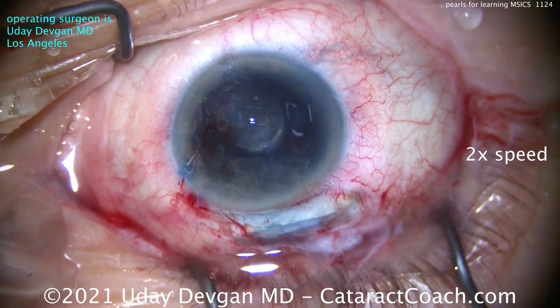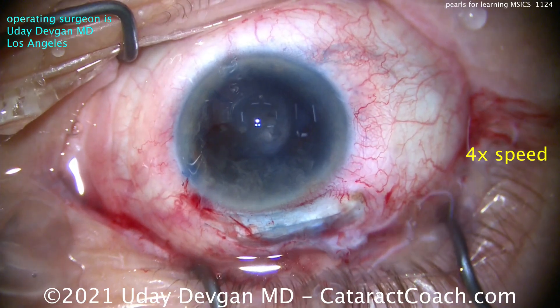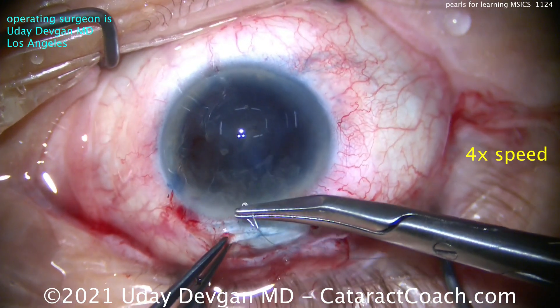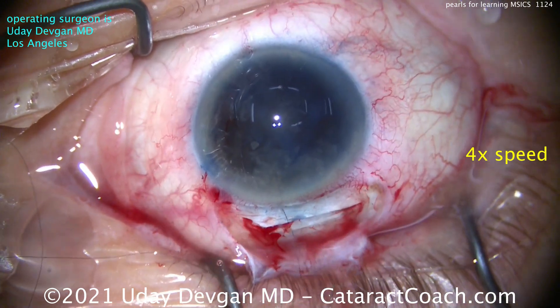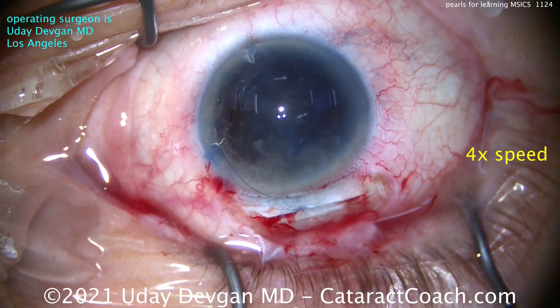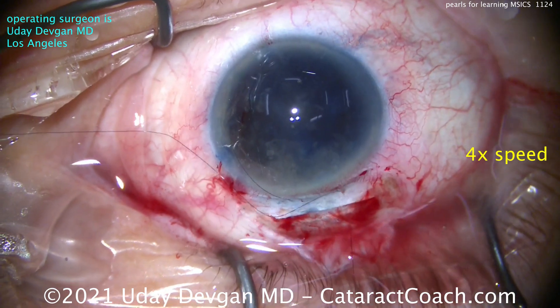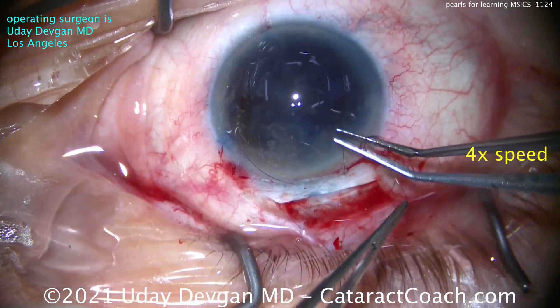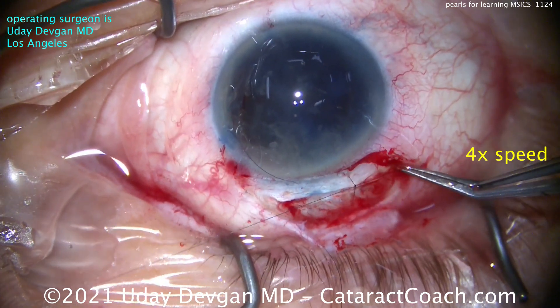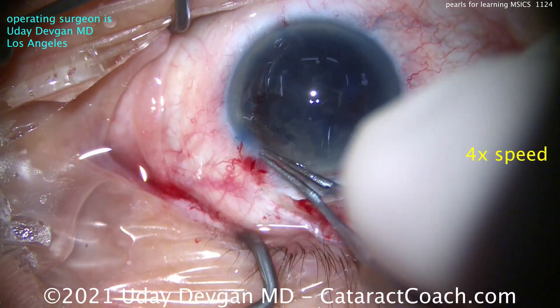If yours gets stuck, you may have to enlarge your incision slightly. Get that nucleus off the field — you can see just how opaque it is. Now for suturing: we place two sutures to trisect the main incision. The main incision is about nine millimeters wide, so two sutures give three segments each about three millimeters wide. While some surgeons do MSICS without sutures, I think your patients are better served by placing at least a suture — at least in my hands.